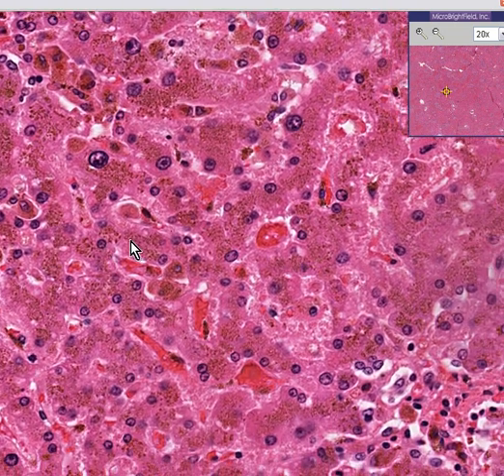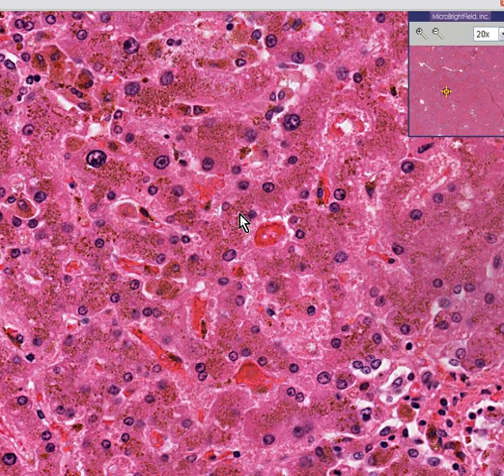And the reason why it's doing that is because it cannot be cleared properly, perhaps due to a genetic defect or a variety of genetic defects seen in hemochromatosis. Normally, hemosiderin does not accumulate in the hepatocytes. It may accumulate a little bit in these Kupffer cells because they are macrophages, but it is not supposed to accumulate in the hepatocytes. So I'll give you two definitions now.